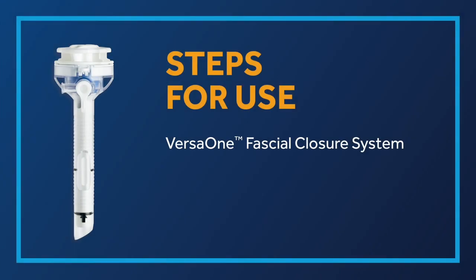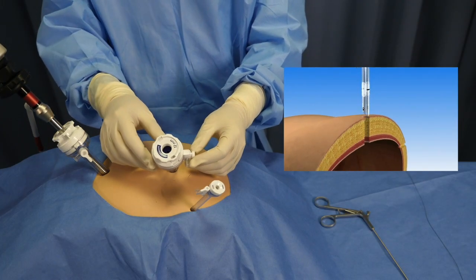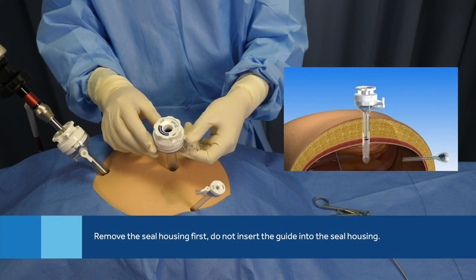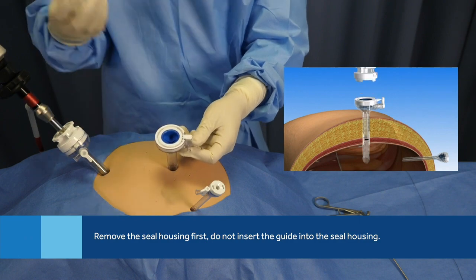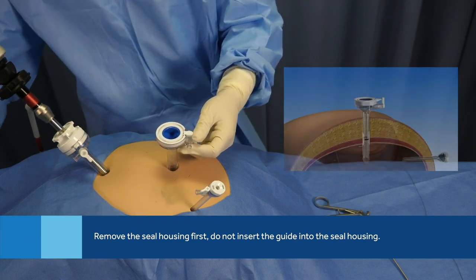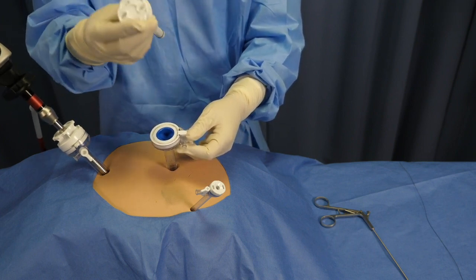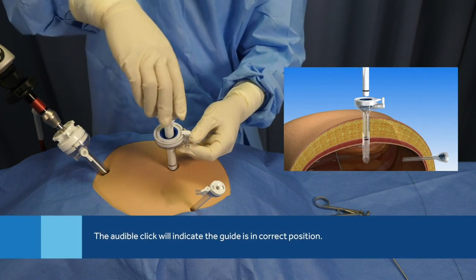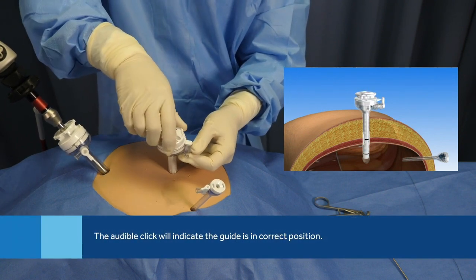Now let's see how the VersaOne Fascial Closure System is used. When you're ready to close the Trocar defect, first remove the seal housing on the cannula by rotating the self-adjusting seal counterclockwise while depressing the specimen removal button. Do not insert the guide into the seal housing. Fully insert the disposable guide into the cannula and rotate clockwise until an audible click is heard and the guide is locked in place.